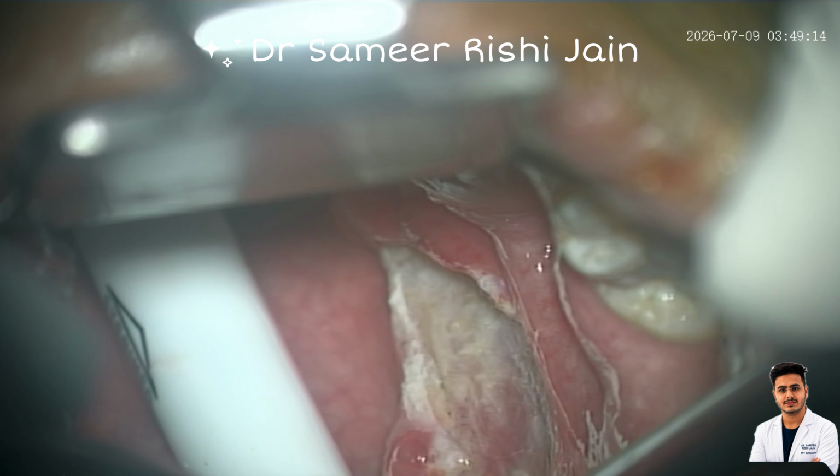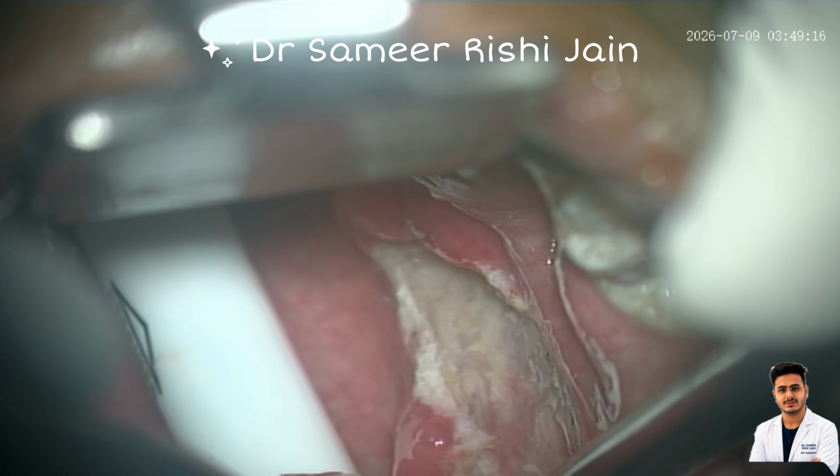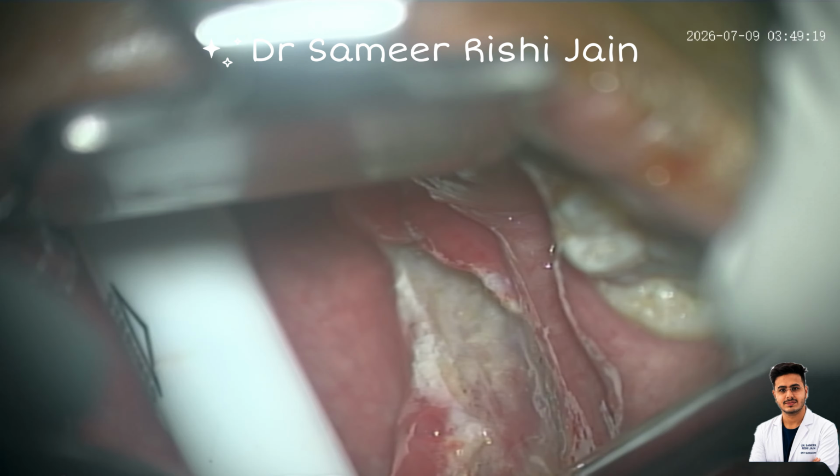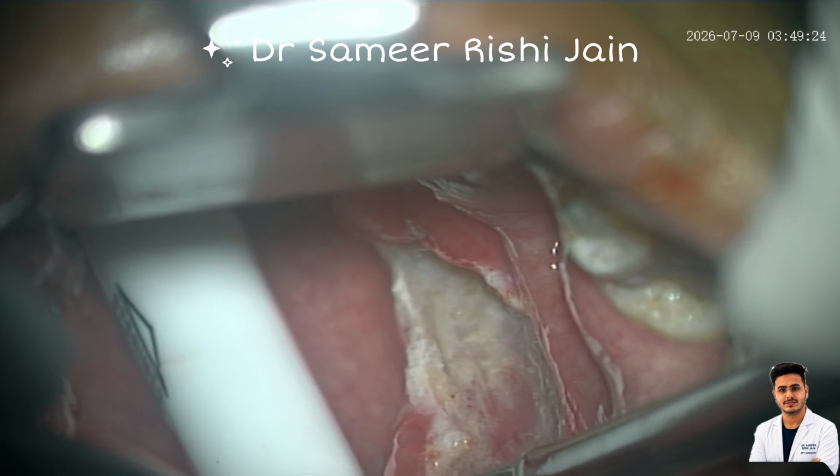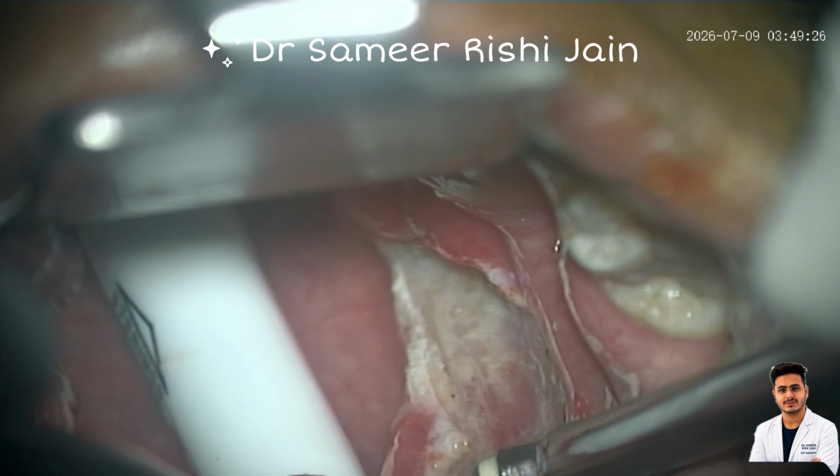So our tonsillectomy procedure is complete on the right side. I'm just finishing up this side by doing a little bit of the coagulation so that there is no post-operative bleeding. So this is for this video.